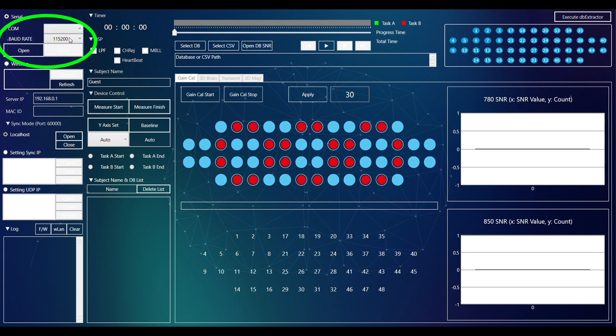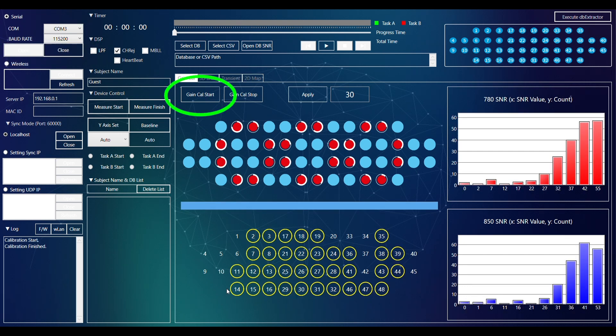To start, select the Serial checkbox and select the relevant COM port. Once selected, you can start the calibration process.